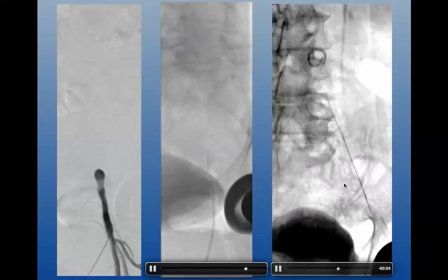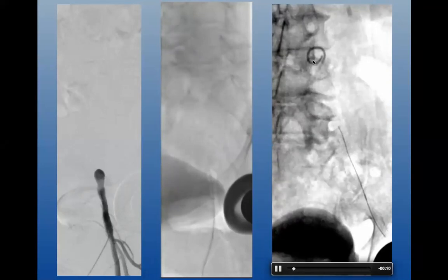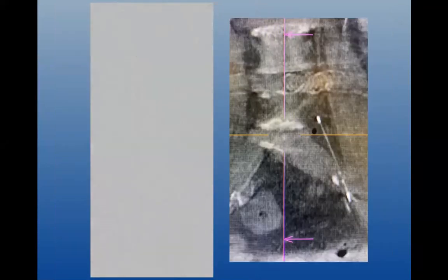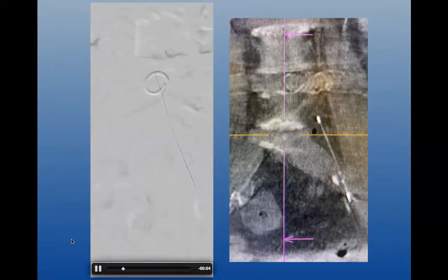And you can see basically that I am recanalizing with the catheter and the wire, and I basically reached my pigtail, which is at the bifurcation. And so at this point I thought, wow, look at this. This is great. I'm almost done. It took less than like 2 minutes, right? So what did I do? And this is one thing I want to teach everybody.